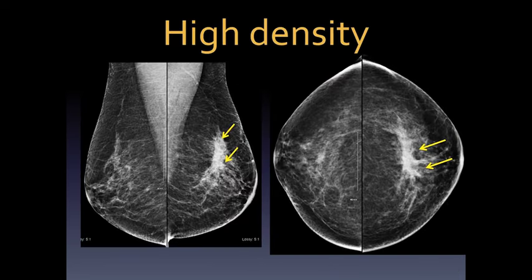Here is another example of architectural distortion where you can see all these lines coming right to the center — they're all very irregular, different, and the center is quite white or dense. This is the CC and the 90-degree medial lateral view, and this is a small invasive ductal carcinoma associated with marked architectural distortion.